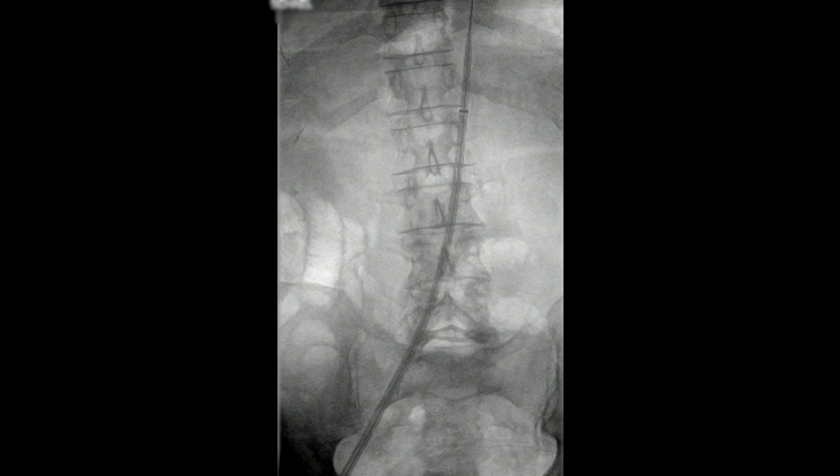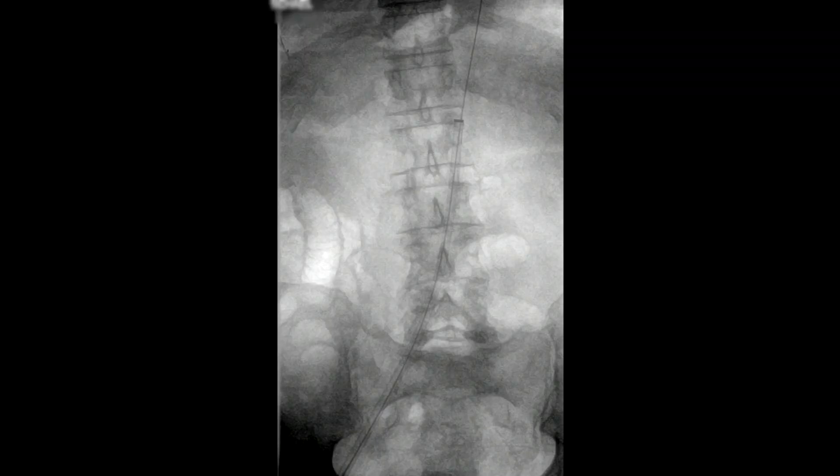We only had unilateral access. We did not access the contralateral side. Once the sheath was up into position, the dilator was removed.